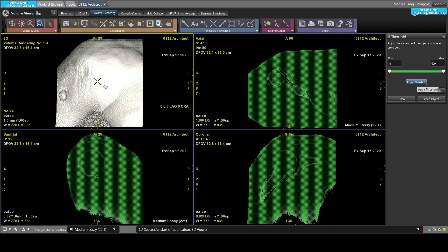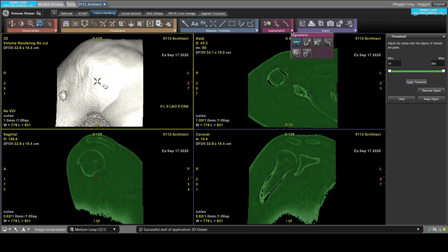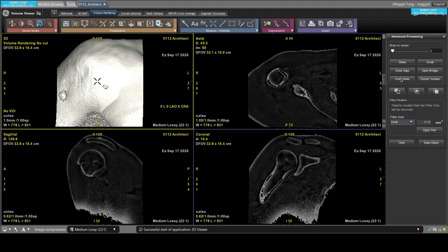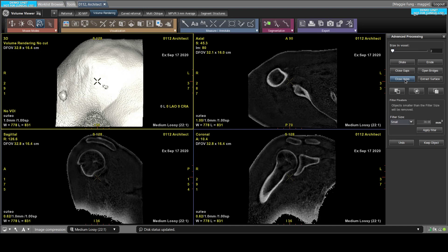So now you see some of your bone is thresholded out, so you'll want to fill that back in using the segmentation advanced processing tool and the close holes tool underneath it. So once you press close holes, it will close all the holes and you get all your bones back.